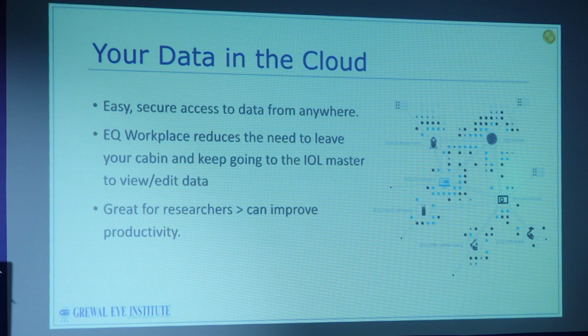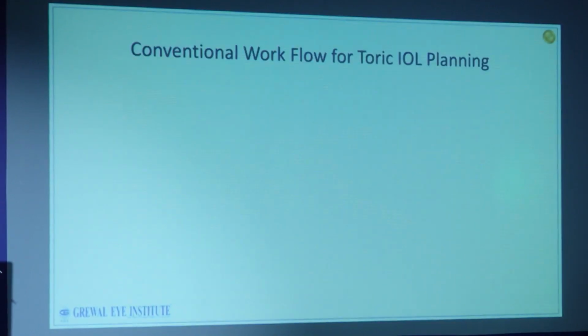The other great thing is that with all this data readily available for researchers, it makes things much more efficient and effective, and it's very convenient to pick up data for when you have to make a presentation also. So one thing that we might be relatively more familiar with is the whole markerless toric surgery platforms that we have available, for example, Callisto.